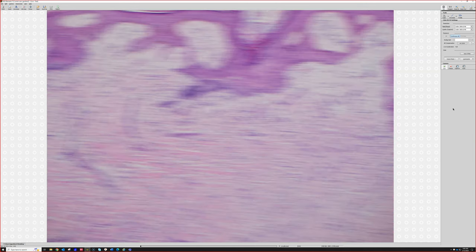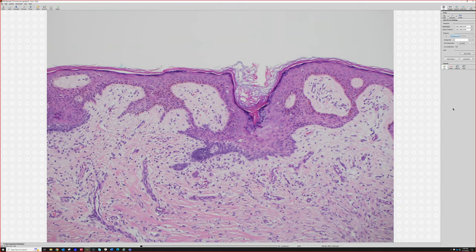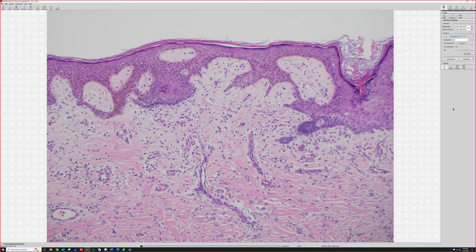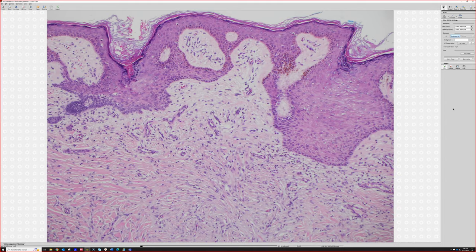cells. So if we're on a test, if you think it looks like a basal cell and there's a DF under it, the answer is no. It's just a dermatofibroma with benign follicular induction. In real life, I've actually seen a small handful of cases of true basal cell carcinoma arising out of or over a dermatofibroma. And one of them actually had benign induction and basal cell over a big, huge dermatofibroma. You can see that. I've got that case, digital slide of it on Kiko. So weird stuff happens, right?